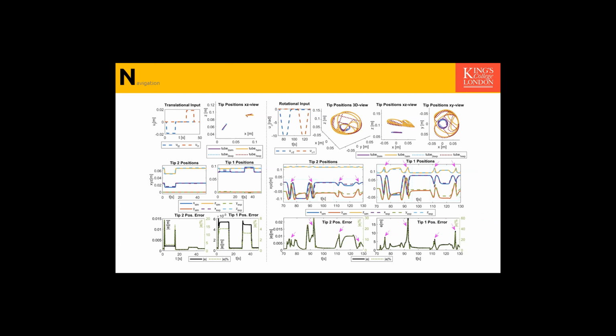But the goal here is having a seamless and unified framework, being able to capture all of the motion back and forth without a need to switch between the models, as in Caleb's work. With your comment earlier, you seem to hypothesize that your model can capture hysteresis in the nickel titanium. We implemented nonlinear damping, and it showed that by tuning the damping, it can capture the hysteresis, but the mechanics of hysteresis is not implemented there. Oh, I see. Okay.